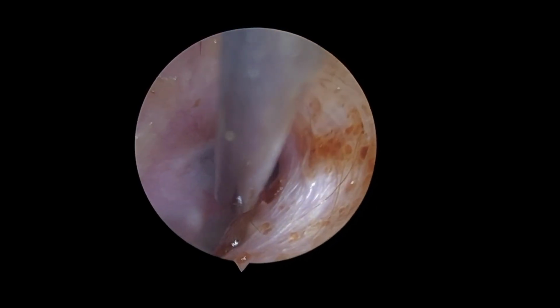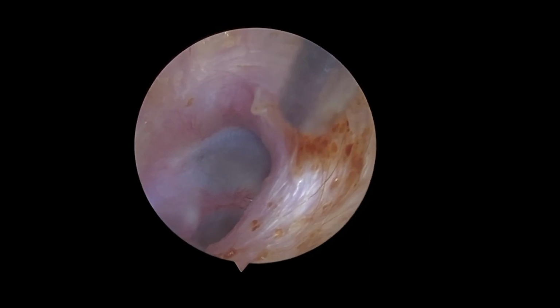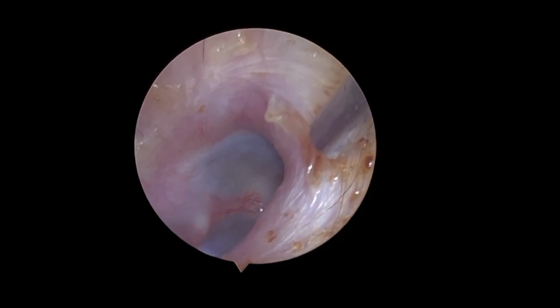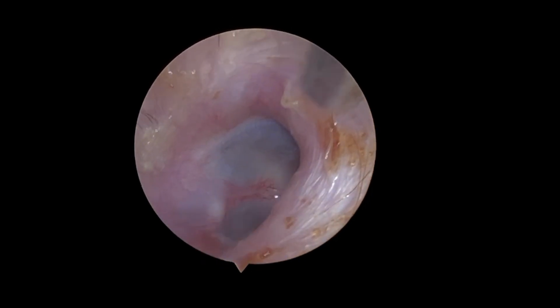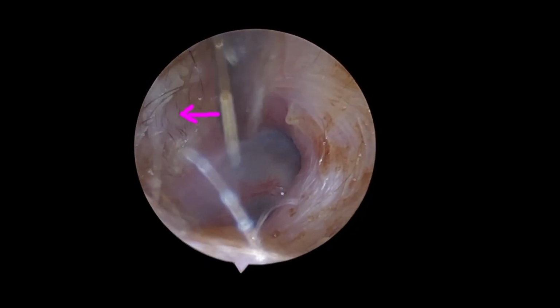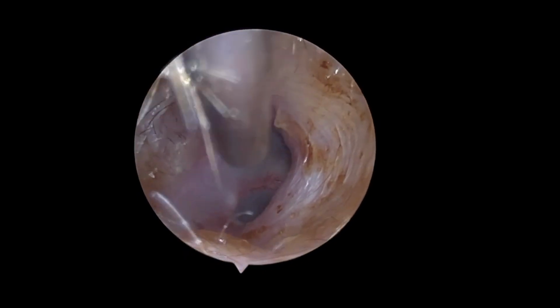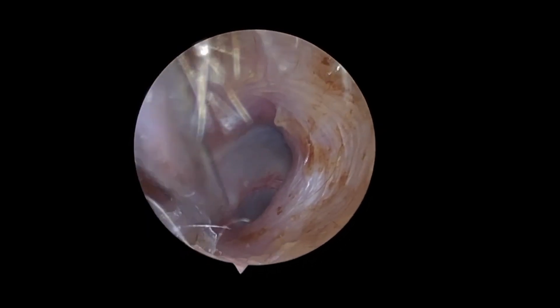There is something a little bit unusual in King Baratheon's ear, which you may have noticed. He has small vellus hairs that extend deep into the ear, just here. We don't usually see these as far down into the ear canal. They're usually at the entrance of the ear canal, the first third of the outer part.